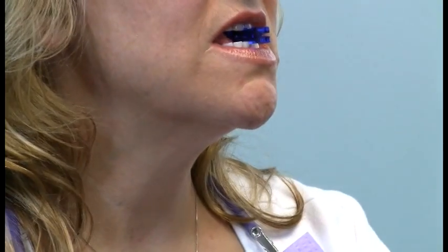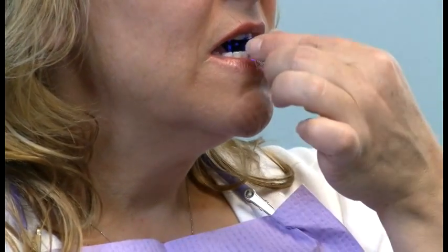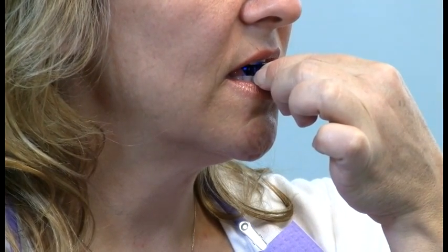Now we're going to go to 3-6. We've turned that around. She puts it in the same combination, reversed. 3-6. That's a 5, but a little less comfortable, okay. And now we're still at the 6, and we're going to come back to the first notch on the top, which will move her 4 millimeters anterior at 6 millimeters.